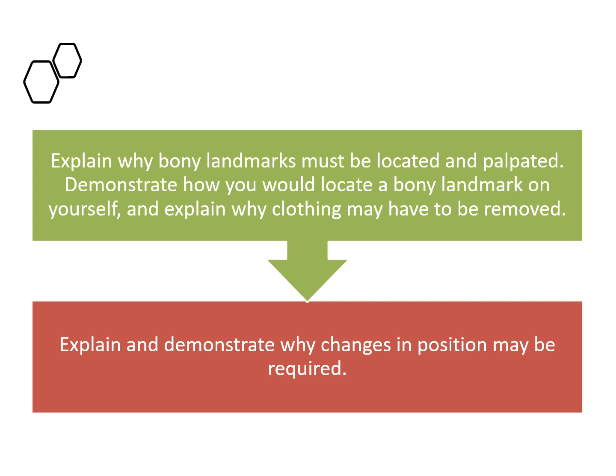Explain and demonstrate why changes in position may be required. For a particular joint, if it's the shoulder also, you need to change position for abduction, adduction, external rotation. So every time you have to change position, the patient may get irritated. He will not cooperate with you anymore. So beforehand only, before you ask the patient to come into supine or then come to side lying or then come to sitting, don't do that.